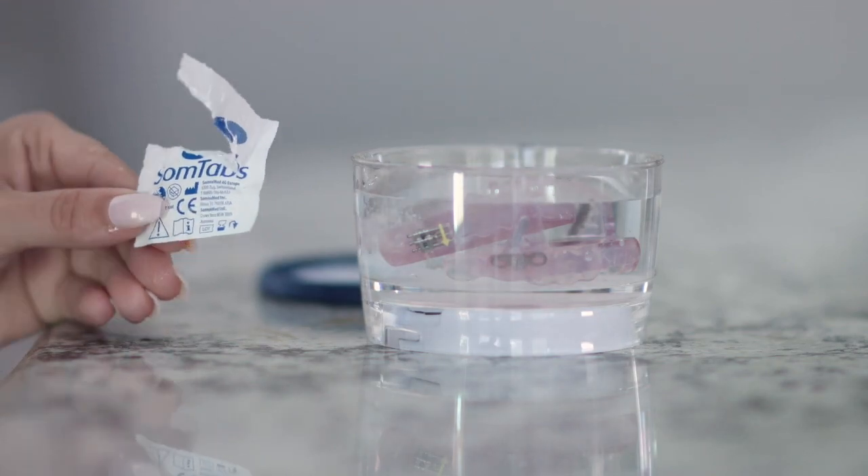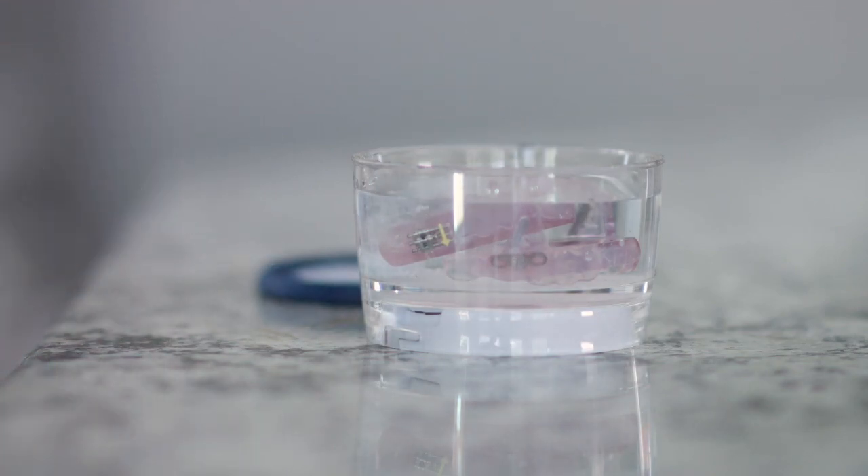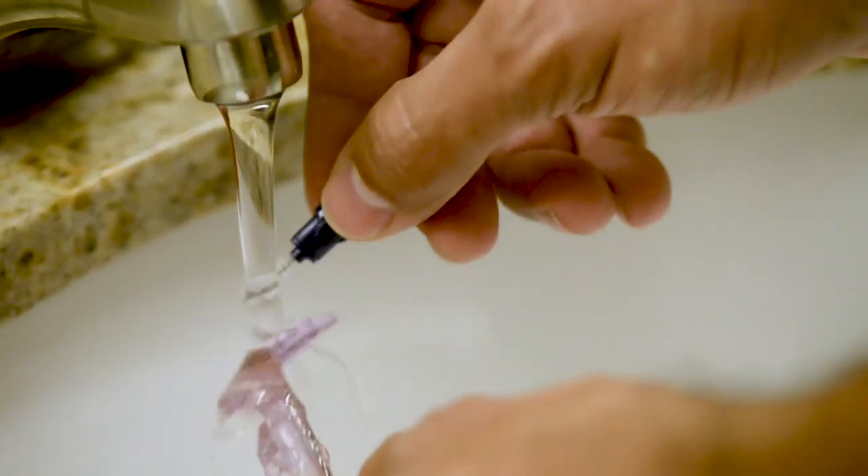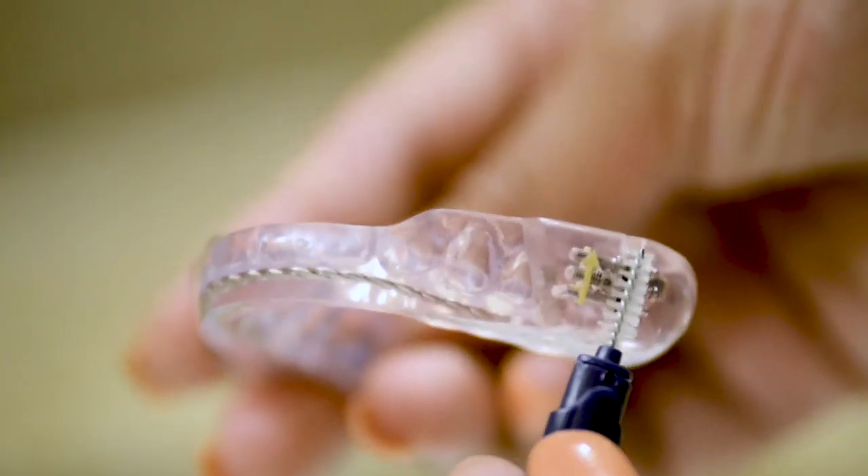Somnodent oral devices maintain their appearance best when cleaned and stored properly. Somtabs are the preferred method for cleaning your Somnodent device.